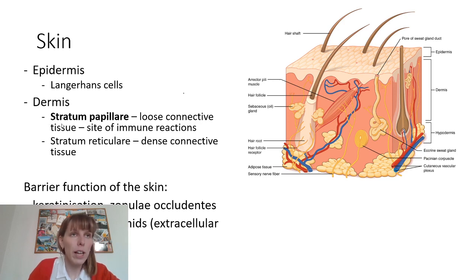It's not called lamina propria here, just reminding you. Stratum papillare, because the skin forms these papillae that you can see, for example, in your fingertips as the fingerprint. I don't know how it's called in English, sorry.